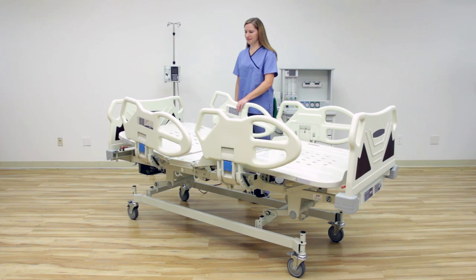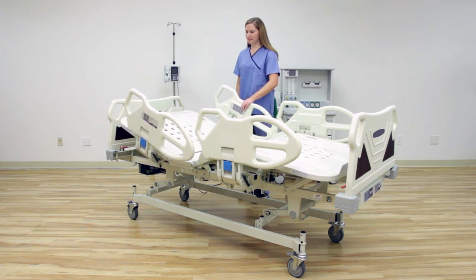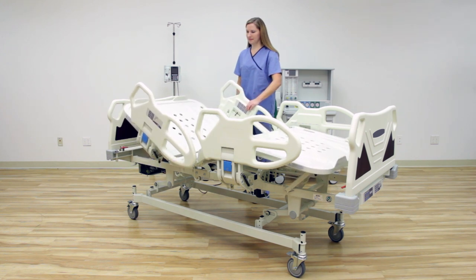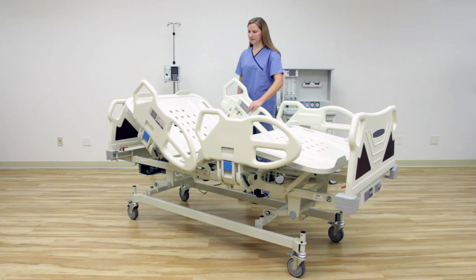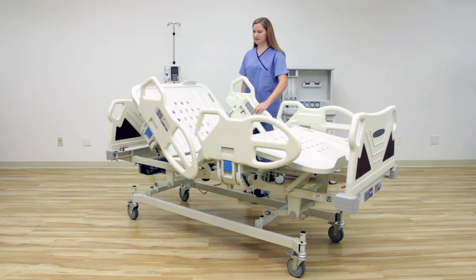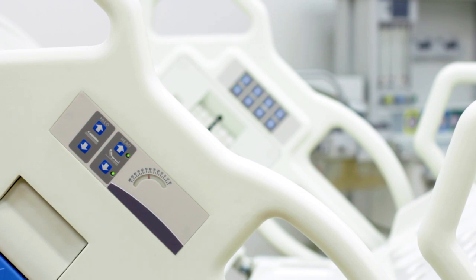The Premio is optimized for many basic motorized functions including height adjustment, independent backrest, legrest, and the auto chair function. The auto chair function simultaneously manipulates the back and knee rests for easy positioning. Patients can rest comfortably by configuring the knee rest from 0 to 45 degrees and the backrest from 0 to 85 degrees.